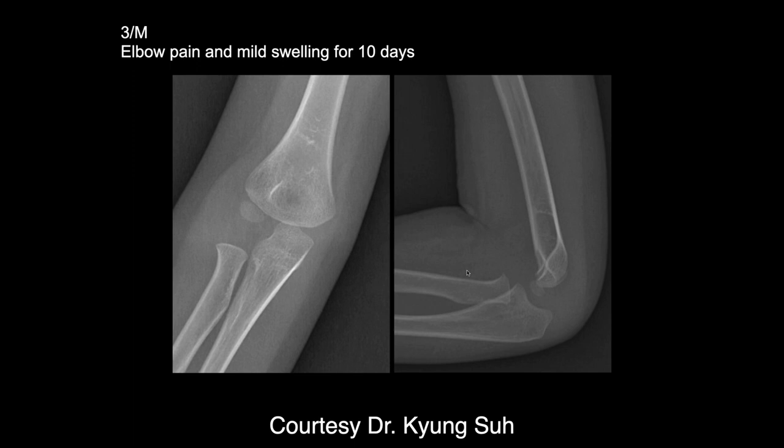If it's a three-year-old male, doesn't it depend on the development of a child whether or not ossification centers are present? Yes. So first you have the capitellar ossification center, which we can see here. Next you'll have the radial head, which is usually age five. So right now he only has one, and the rest are cartilaginous. This elbow in terms of growth is normal.